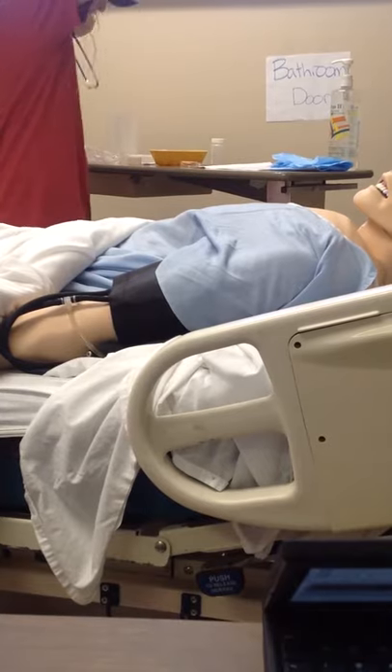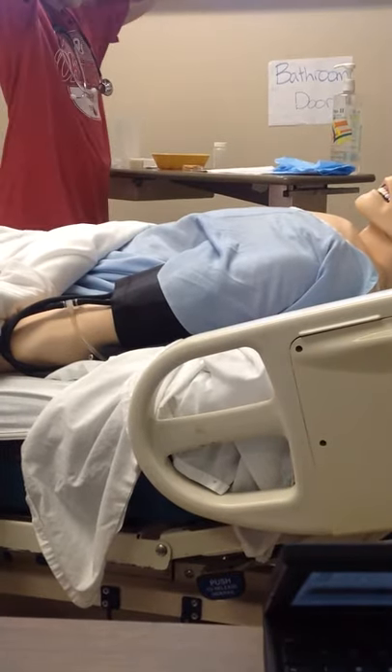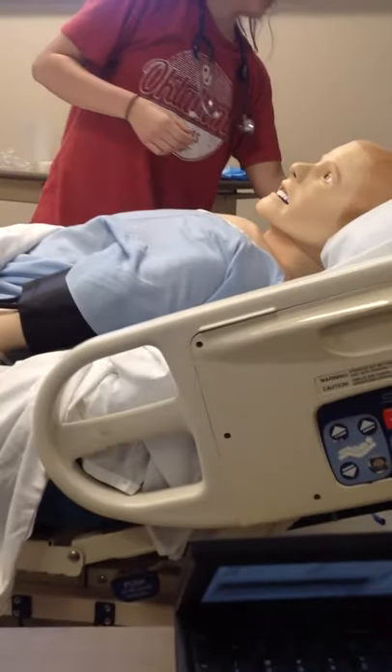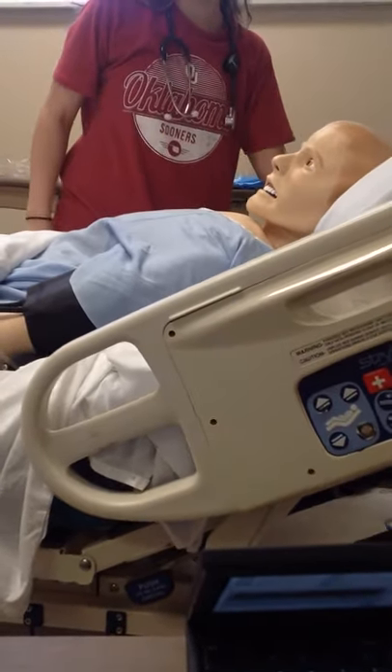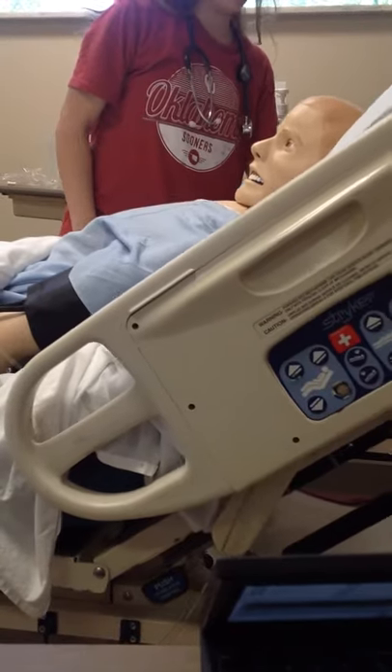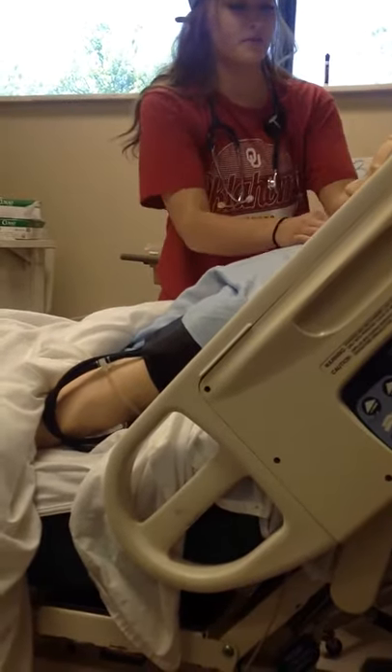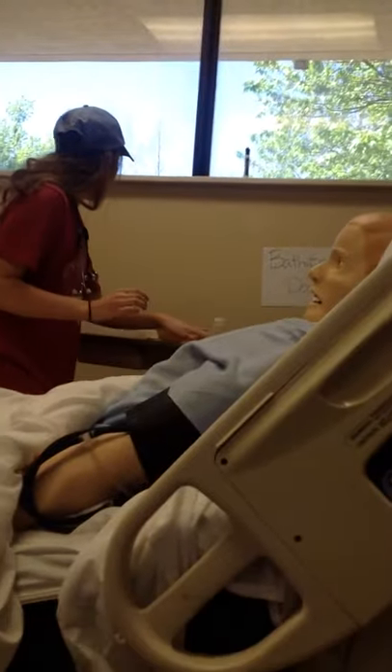Do you have any questions before we start or anything? No, I don't think so. I'm just going to set you up. Is that comfortable for you? Yeah. You're a little stiff there.